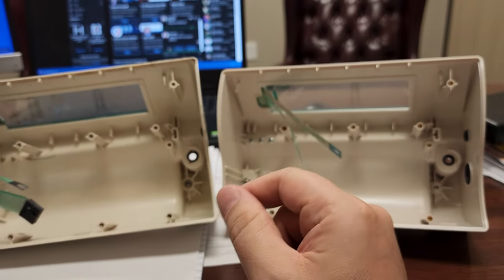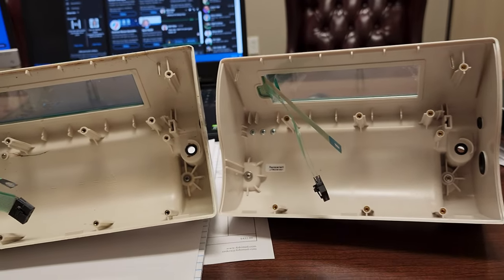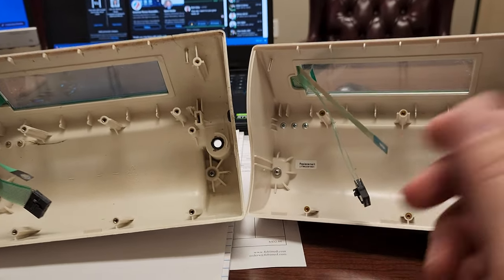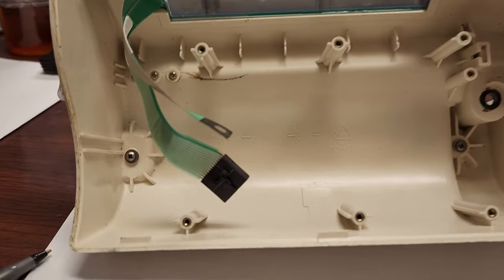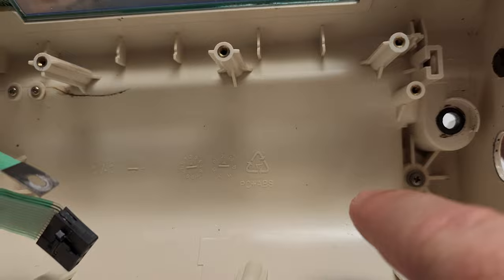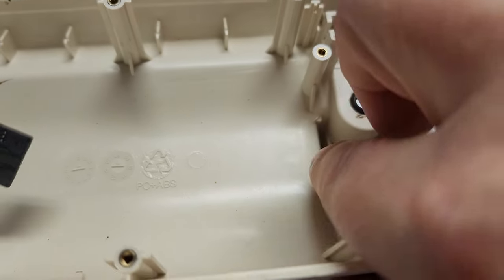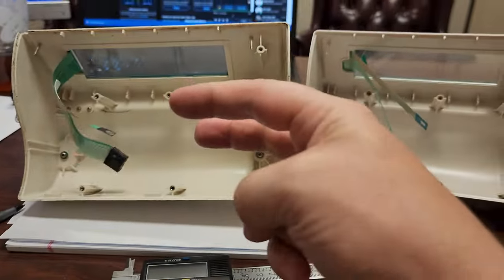Check out FobiMed's video — they show you step-by-step how to change out this top cover for the MedFusion series. Now take a look here: this is an injection molded part. The reason we know it's injection molded is because you see these little spots right here — those are for injection pins.